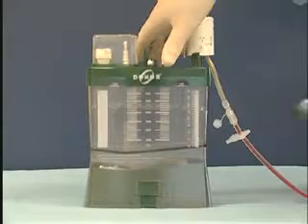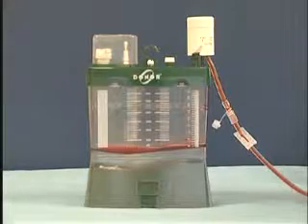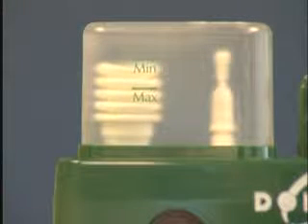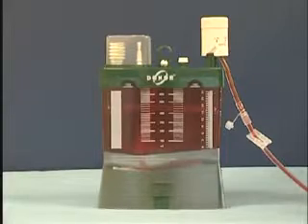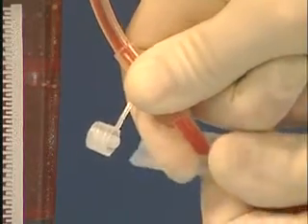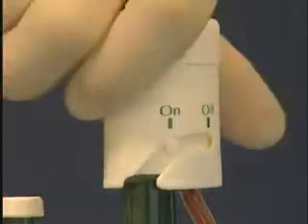The drainage is started by opening the sliding clamp. When the Donor system is closed or when the drainage is stopped, we close the sliding clamp. The Donor system is closed by turning the vacuum regulator to off.